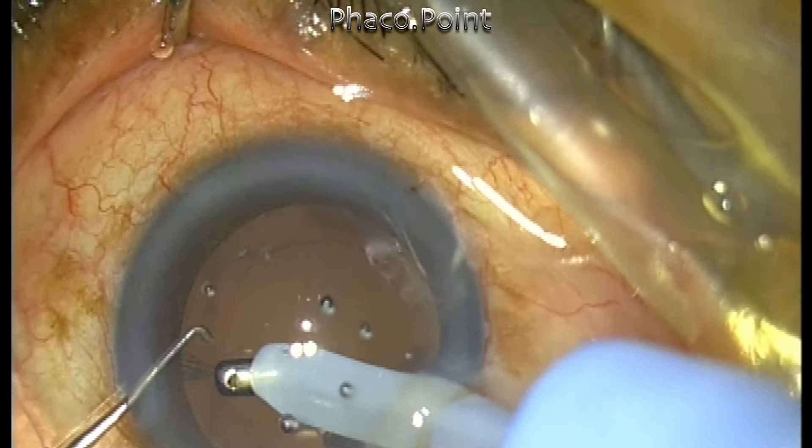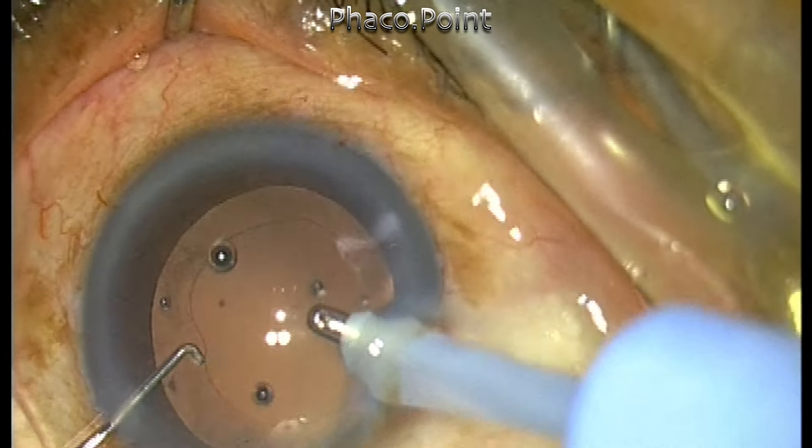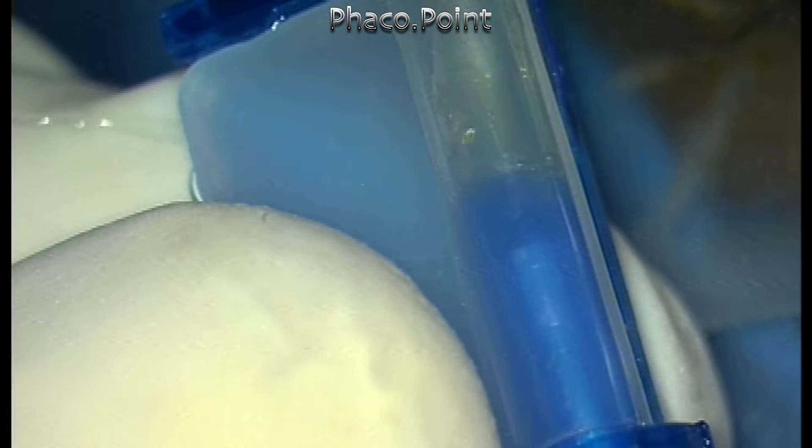After the cortical aspiration, I'm going to implant a lens. This is a multifocal IOL that comes prepackaged. I decided to load the lens myself. I injected viscoelastic onto the lens and noted it was nicely in position, then closed the flaps.